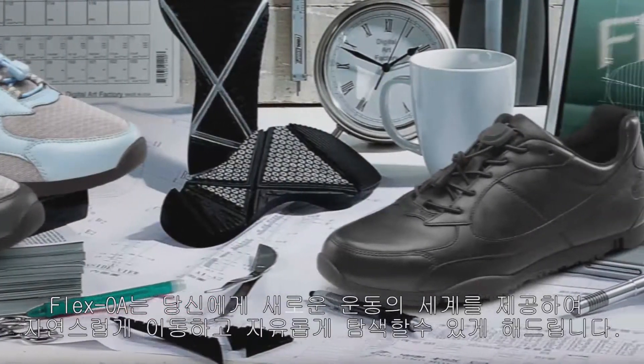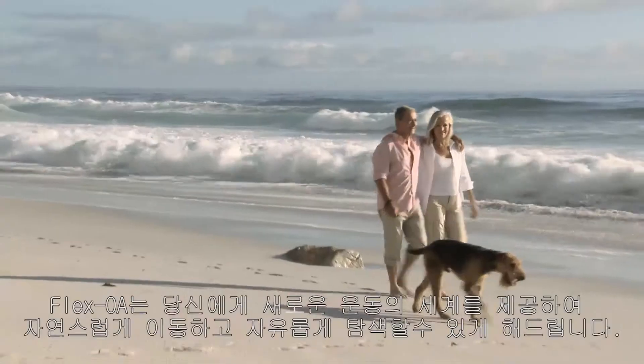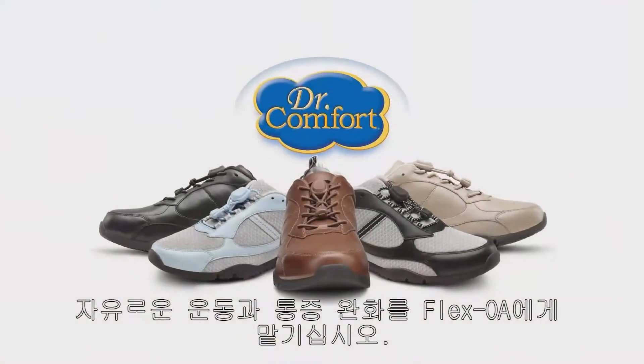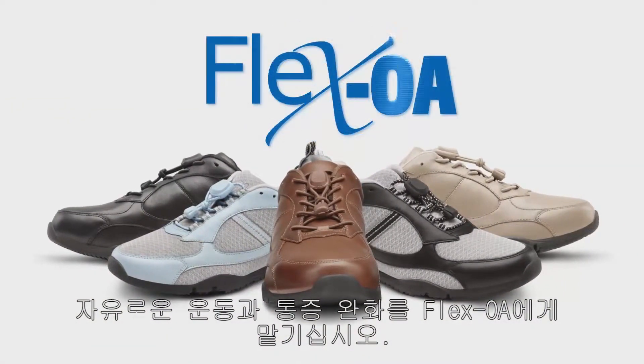Flex OA gives you a new world of motion — a world that's yours to explore, where your natural motion actually reduces pain. Free motion with less pain. Try Flex OA and let your natural motion reduce your pain.